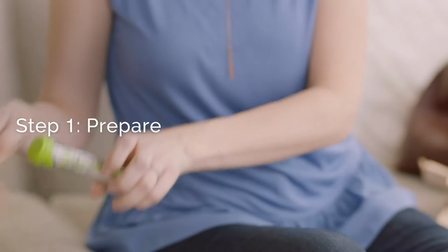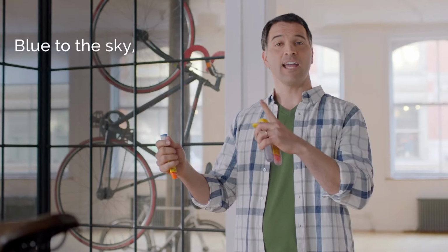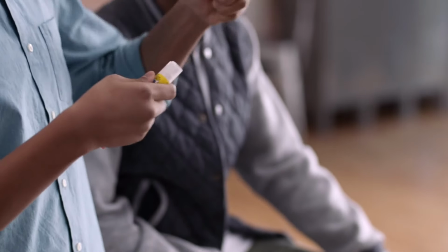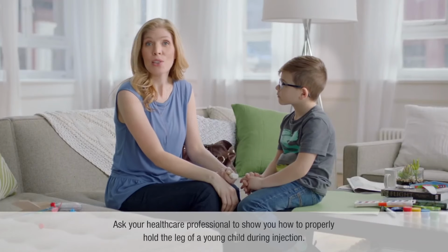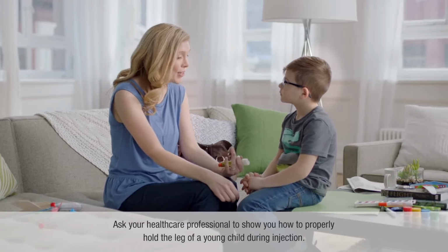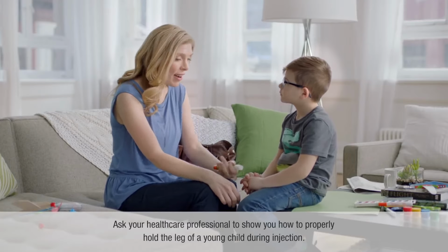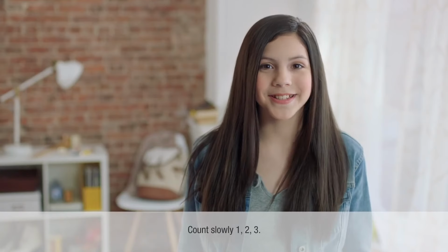Whether you need to use Epi-Pen on yourself or give it to someone else, you can just follow these simple steps. So first things first, you take it out of the tube. Just flip open the yellow cap, Or the green cap. slide it out, and hold it like this. Blue to the sky, Orange to the thigh. Then you take off the blue cap. Blue safety release. never put your hands near the orange tip because that's where the needle comes out. The needle is designed to go through clothing, including jeans, because it must be injected into the outer thigh for quick absorption. If you're helping a young child, Like me. hold the leg firmly in place. Once it is, You just do this. Boom. It clicks, so you know it worked.